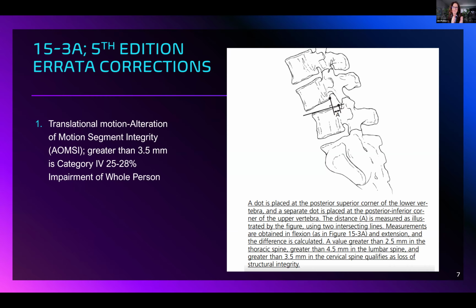Anytime I see it's just 2 millimeters, 3 millimeters, like 2.0, I question whether or not they really measured at all. I see that a lot, even on MRI. It's just, oh, it's about 2, it's about 3. Wouldn't you agree too that the human eye cannot see a lot of this? You miss too much, especially for those that are just eyeballing it. Absolutely.